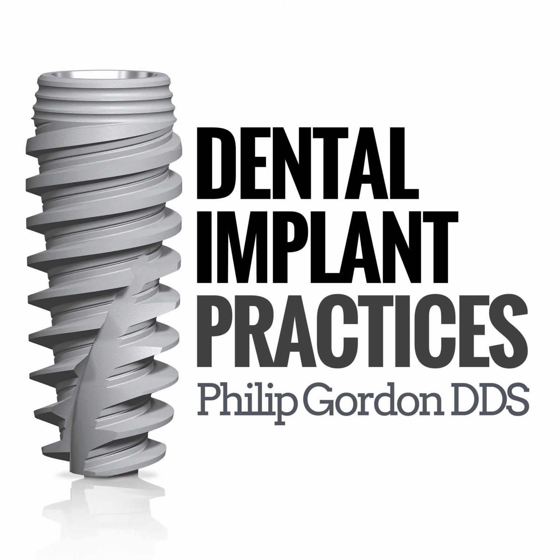And if I have 6 implants to place, we're doing that within an hour. And so you can start thinking, not only is this better for the patient because it's less surgical trauma, the surgery's quicker, they're going to have less swelling, less soreness, but if I can open up another hour in my schedule every day, that means I can either do 2 more sets of wisdom teeth or I can go home an hour earlier, which is really nice. So there's a lot of benefits from guided surgery.